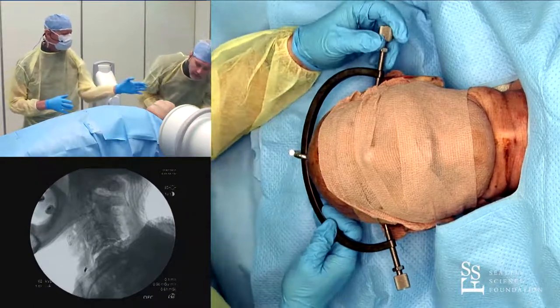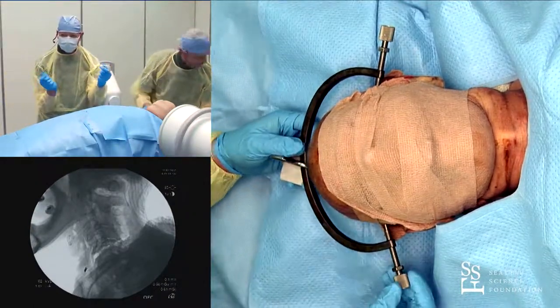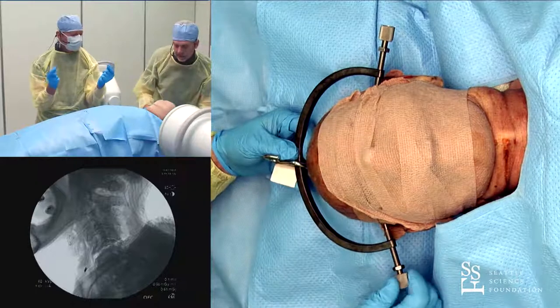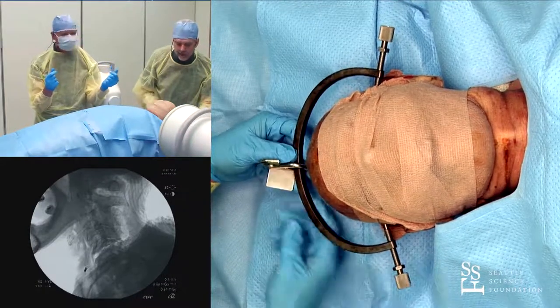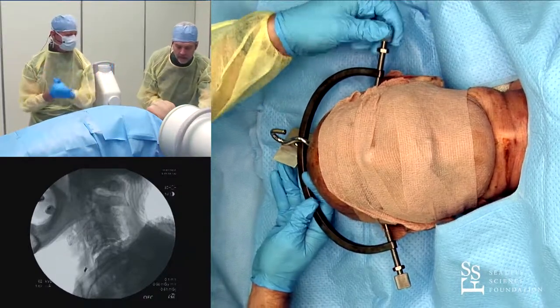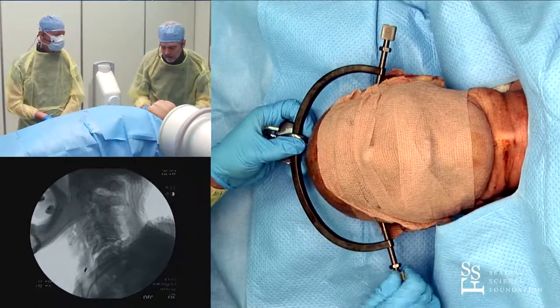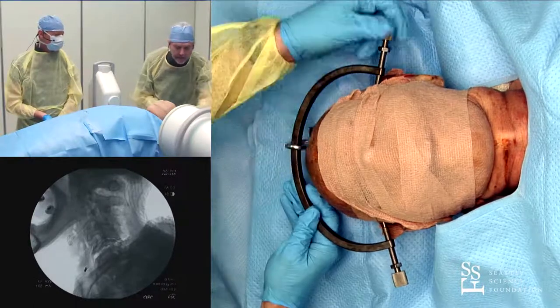I'd like to stand directly at the head of the patient with both hands on each knurled knob, and simultaneously tighten both with both hands at the same time. You need to understand which direction you're tightening — you don't want to tighten one and untighten the other. Symmetry is the whole idea here, so you don't end up with the scalp or skull rotated to one side.